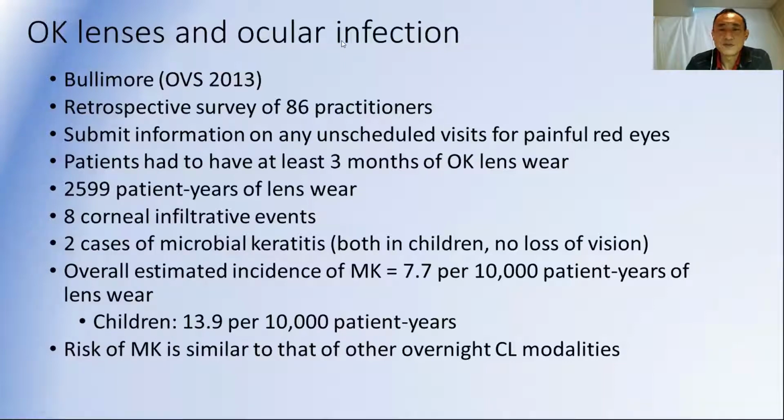Okay, is there a difference in myopia control in axial myopia and refractive myopia? That's a good question, and honestly, I don't know the answer to that. I think primarily with myopia control, we're talking about axial myopia, because we're talking about increases in axial length, and it's found that Ortho-K slows increases in axial length over time.